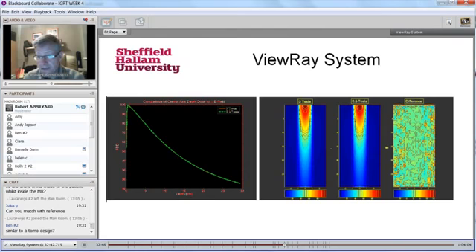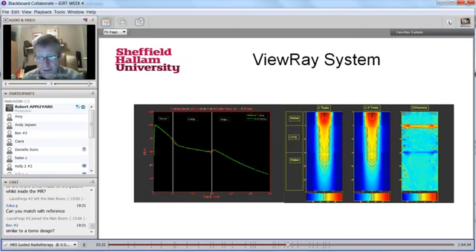We can see on this slide that we've got good homogeneity. If you compare the field profile here with that without MR, and this is the difference over here, that's pretty consistent. So the MR field has very little influence on the delivery of radiotherapy using the cobalt beams. Similarly, compared to MR-Linacs, it has relatively small differences at tissue-air interfaces.